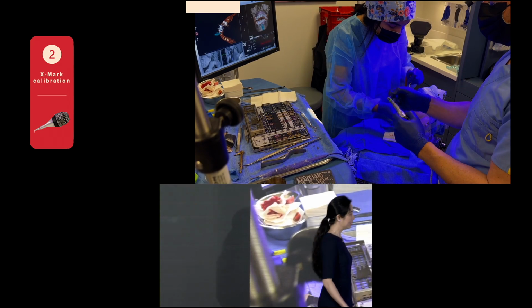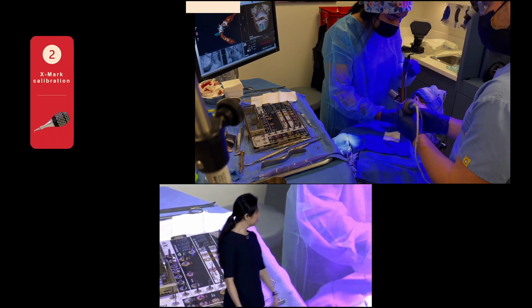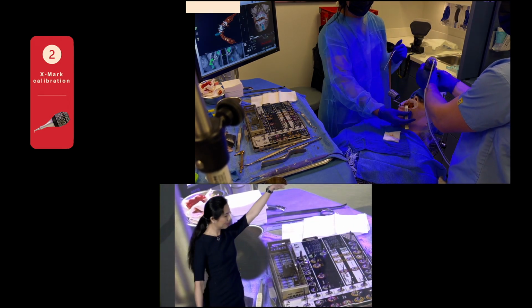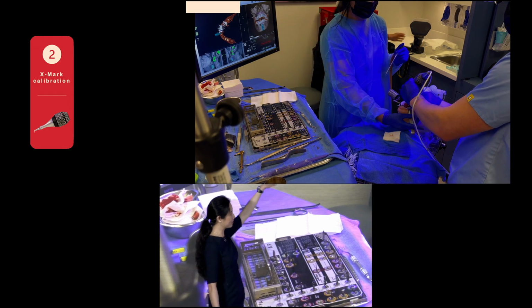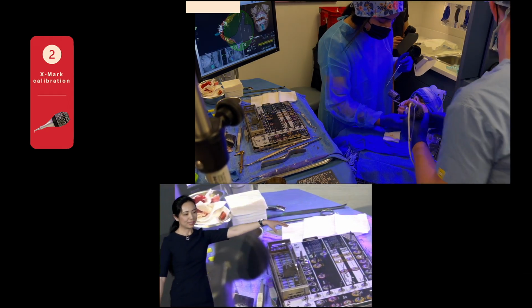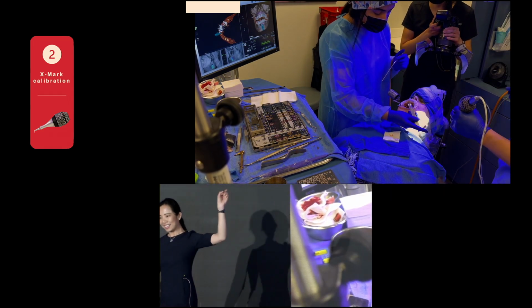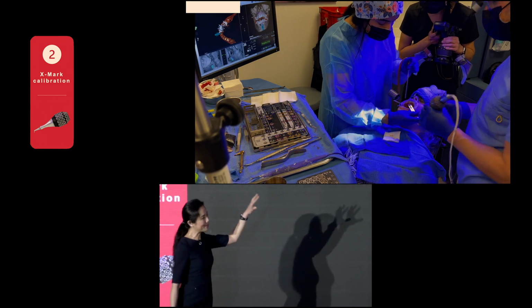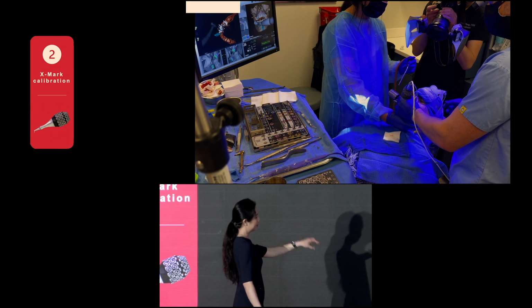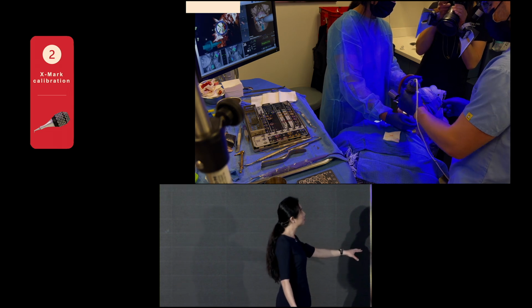Next step is to calibrate the X mark. So what you're seeing Matt do here is to calibrate everything under the scanner that's overhead. That's why there's the blue light being cast. If you're wondering how I'm taking this video while I'm taking pictures in the background, it's because I'm using a tripod. But basically what's going on is that he's calibrating with his pad each time he places another implant.